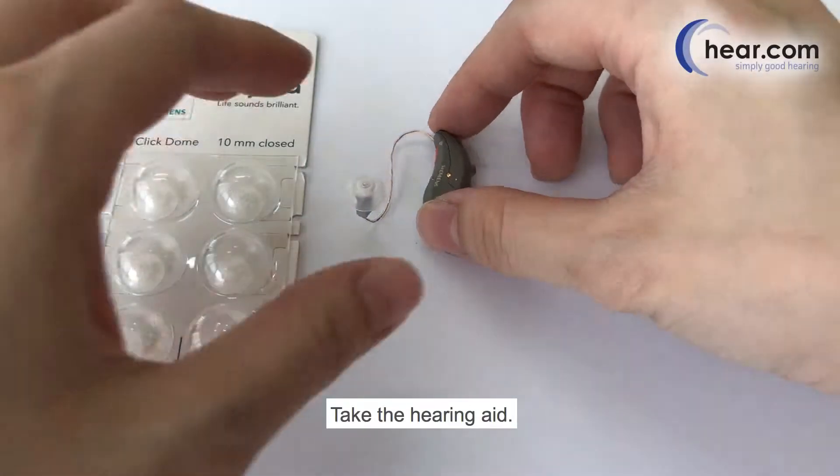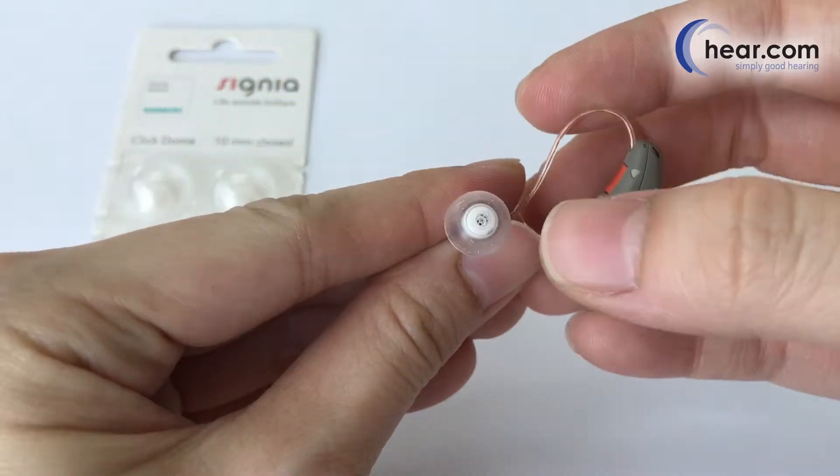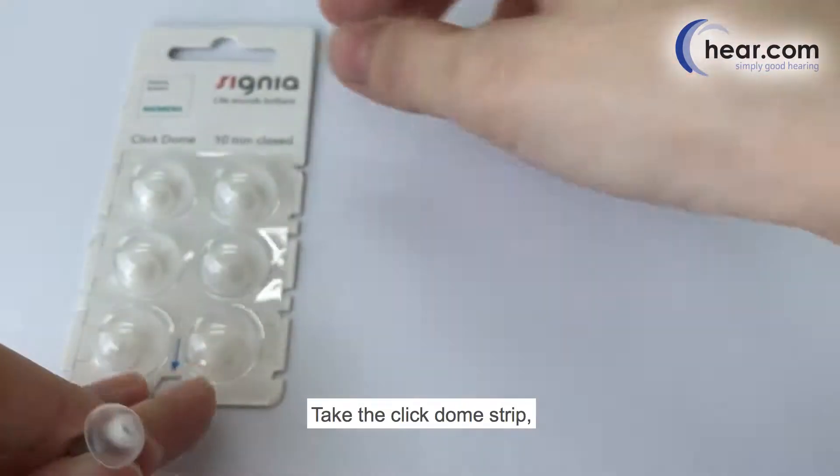How to change a click dome. Take the hearing aid and take the click dome strip.